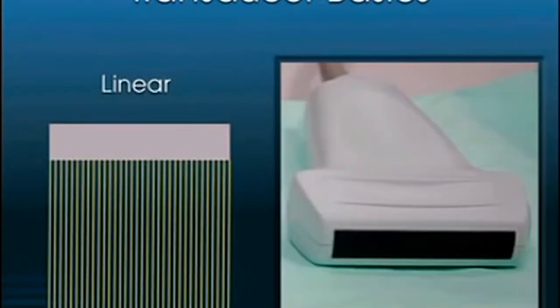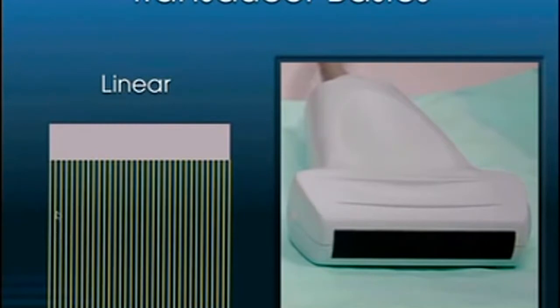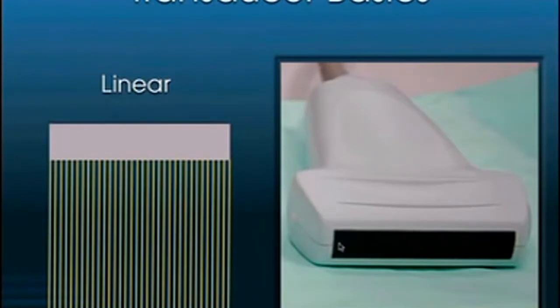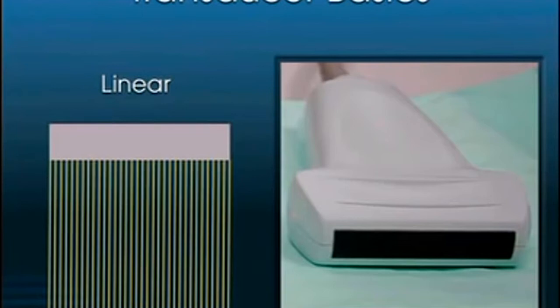The linear probe provides the same resolution all the way across — scan lines are separated equally with no splaying — giving uniform resolution across the entire image. The linear L38, and variations like the L25 and L51, come in different sizes depending on your specific needs. These tend to be high-frequency transducers, good for structures in the near field.